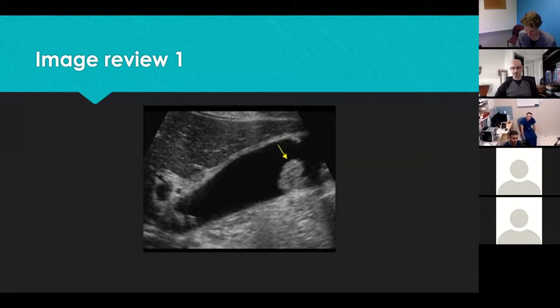It shows possibly a dilated gallbladder and a hyperechoic shadow on the posterior wall of the gallbladder, which is echogenic. It seems to be attached to the wall, but I would like to see more images. I don't see any post-acoustic shadowing there.